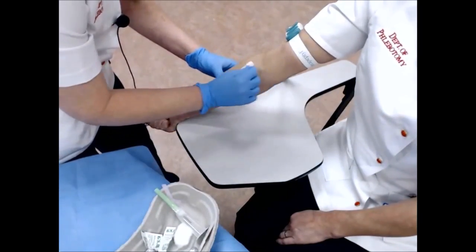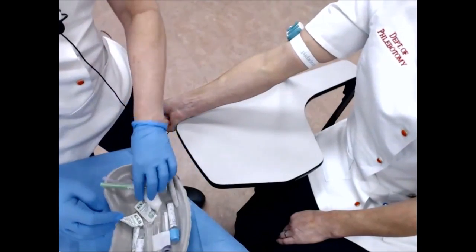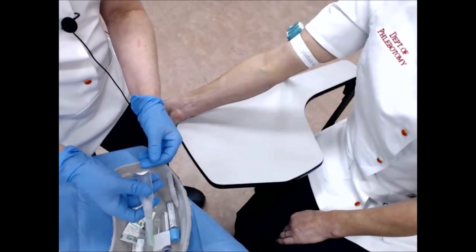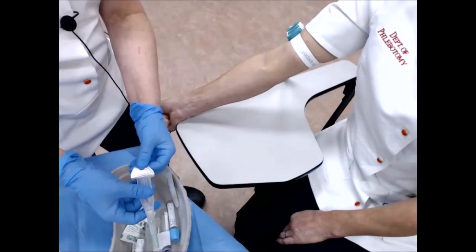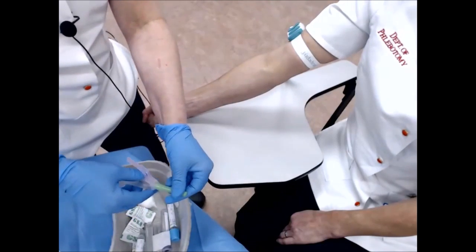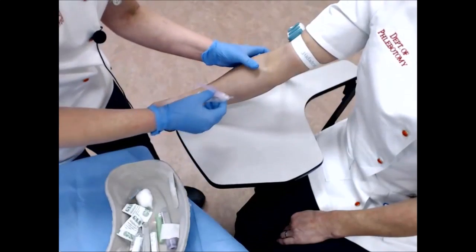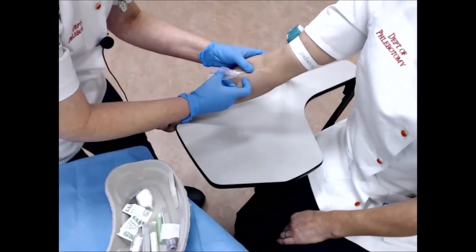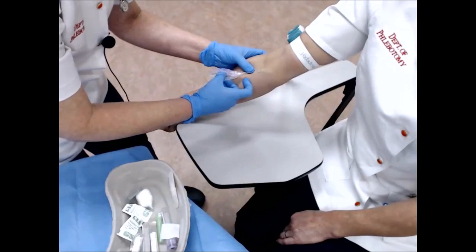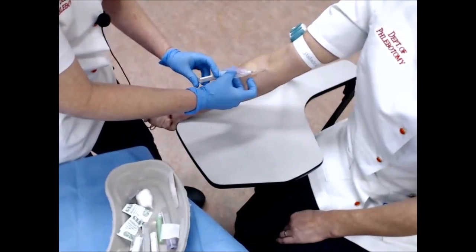I cleanse the area with the alcohol and allow that to dry. While that's drying, I prepare my needle by taking off the protective covering on the bottom, pulling down the top, and removing the lid. Then, while anchoring the vein, at about a 30 degree angle, I puncture — a little pinch.